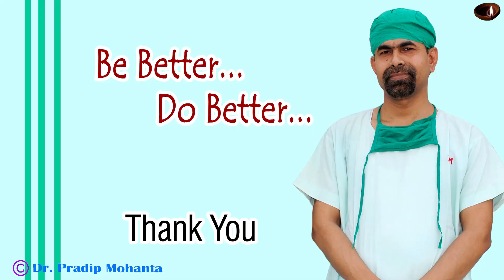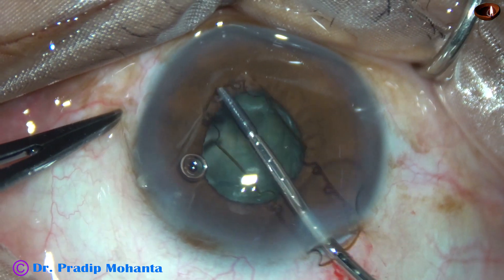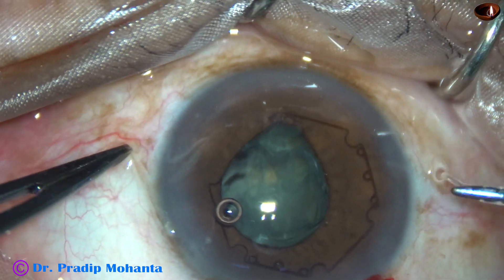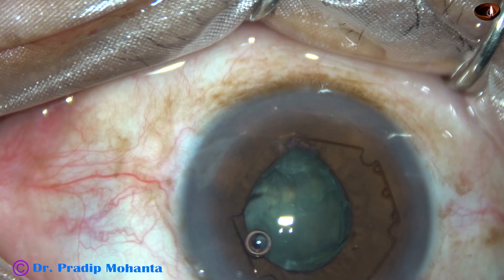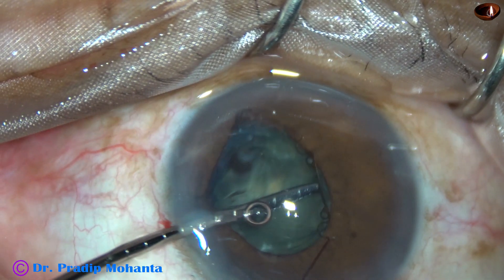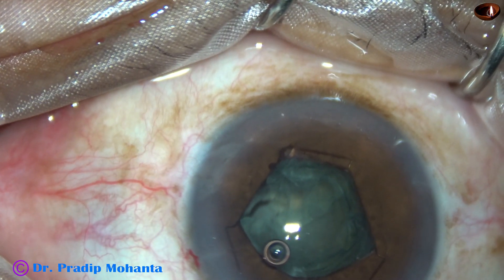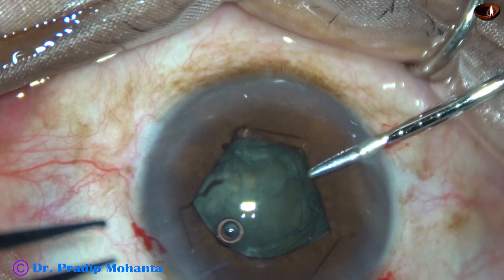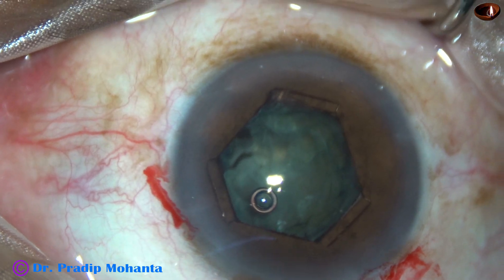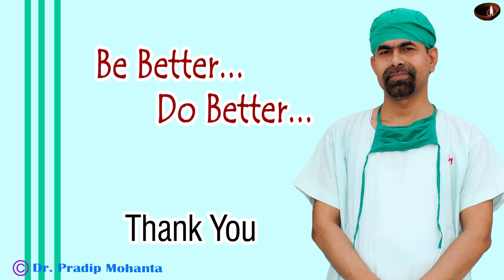Thank you very much for your attention. We can manage when the pupil constricts without using any pupil expansion device. But let us look at the safety of the patient — if our visibility is more, the safety of the surgery is more and we can predict the outcome more reliably. Please don't hesitate to use a pupil expansion device in the middle of surgery. If you don't have one, keep iris hooks and use them. I hope this video will help you in developing your surgical skills. Be a great surgeon and serve your patients with love, respect, compassion, and great surgical competence.